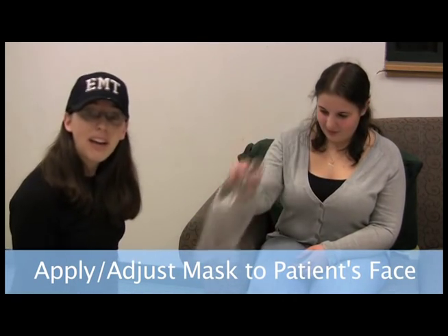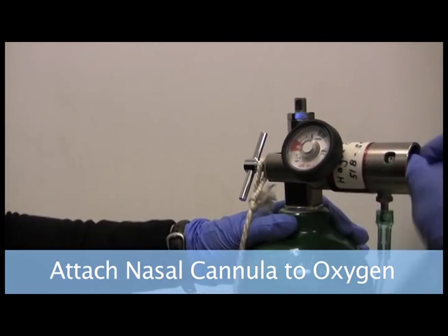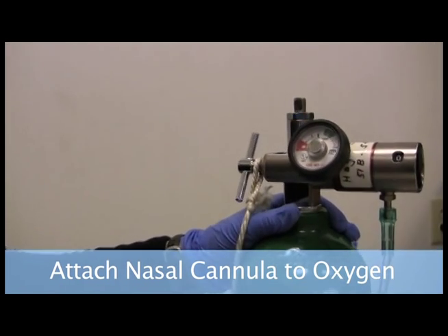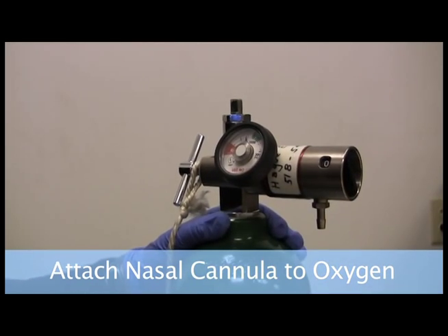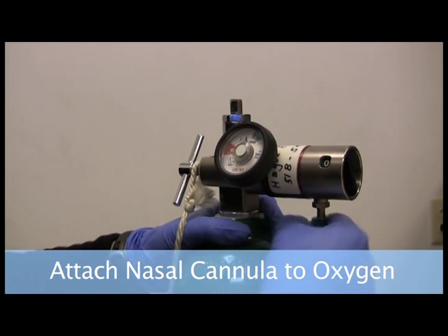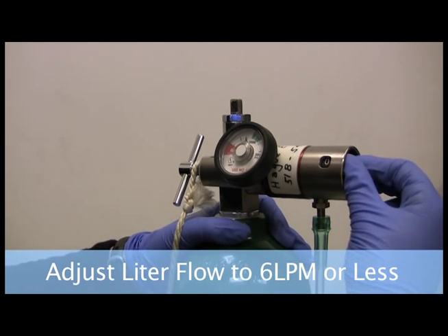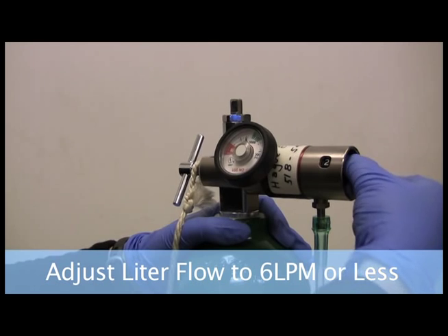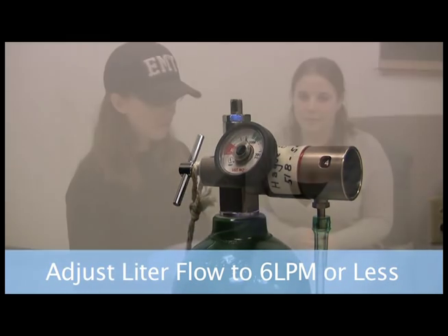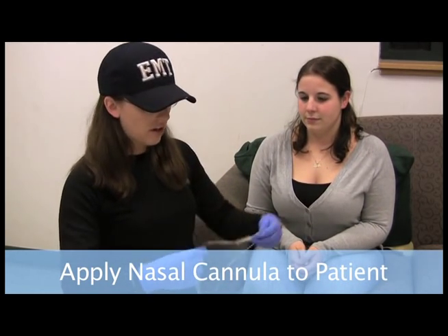And obviously our patient doesn't like the mask. So the patient is not tolerating the mask. So what we want to do is turn it back off and put on the nasal cannula tubing. Works the same way, except for nasal cannula, you're only going to turn it to 4 to 6. For right now, we'll put it on 4. So now we have the nasal cannula hooked up at 4 liters per minute of oxygen.